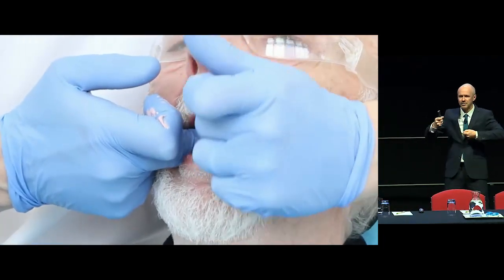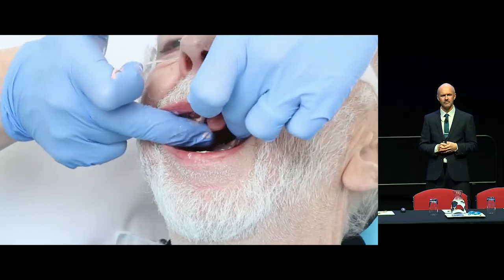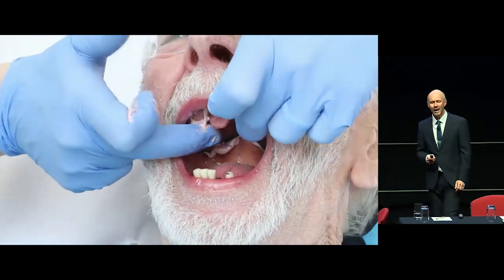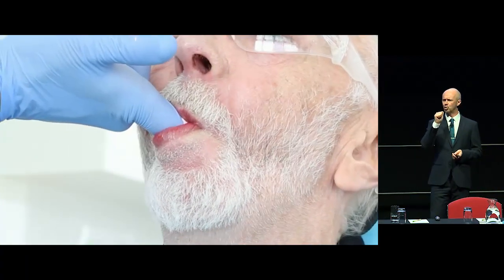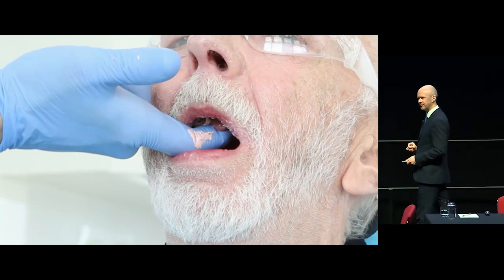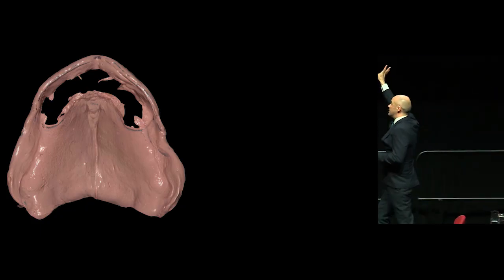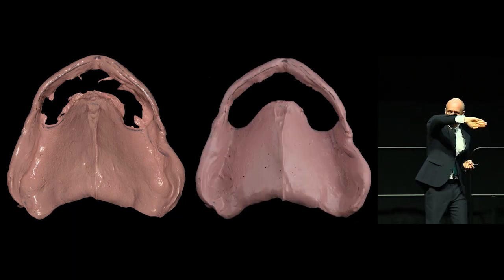I border mould the buccal edges of the cheeks. Then I get him to really waggle his jaw — that's the coronoid process moulding the back of the denture. Then open wide, and finally suck my finger, which contracts the modiolus. I'm really trying to get him to perform functional movements he would do in everyday life, so the denture won't dislodge during everyday social functions. Take that out — it's beautifully moulded at the back. I trim it just with a scalpel to neaten it up, then it goes back in the mouth.